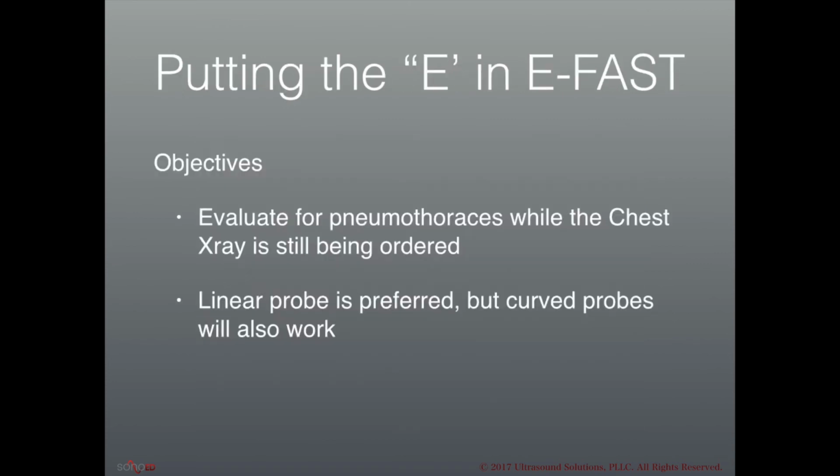Let's move on now to the lungs and discuss how we're going to evaluate for pneumothoraces. This is a very easy technique to learn so that you can be evaluating the patient for this condition while the chest x-ray is still being ordered.